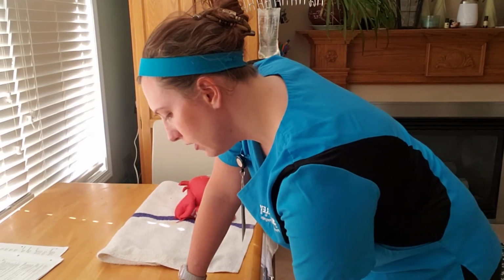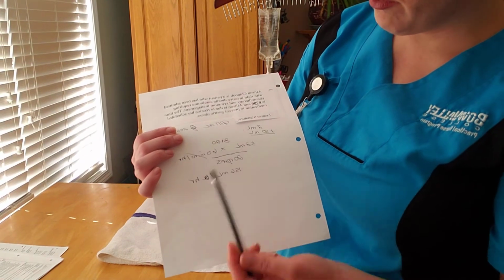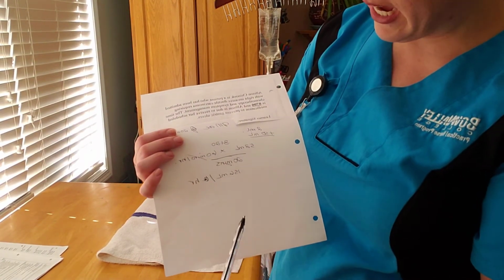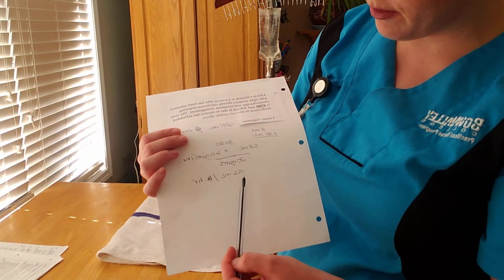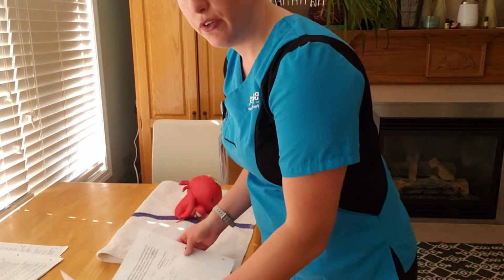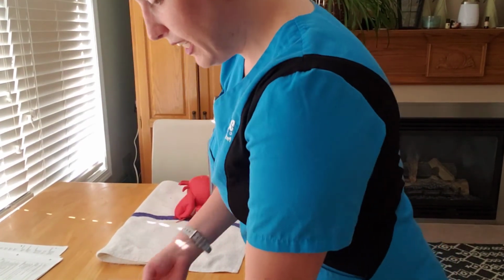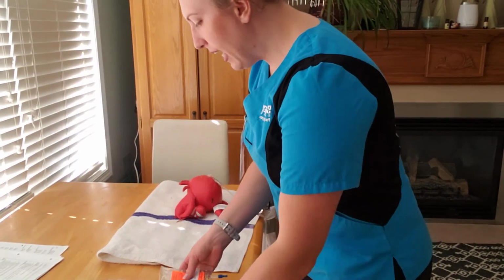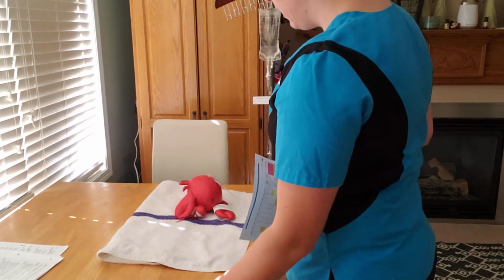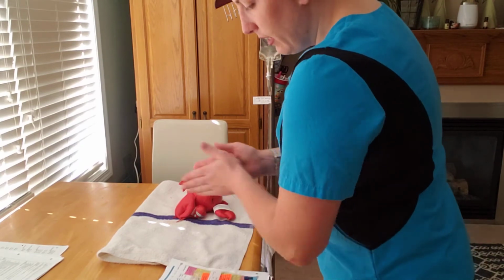Okay, so I've got my total volume times 60 minutes per hour. The minutes cancel, which leaves me with 156 milliliters per hour. That will be our rate of infusion. Okay, so I'm going to take my secondary line, my med bag, and my MAR to my patient. And I'm going to wash my hands when I get there.